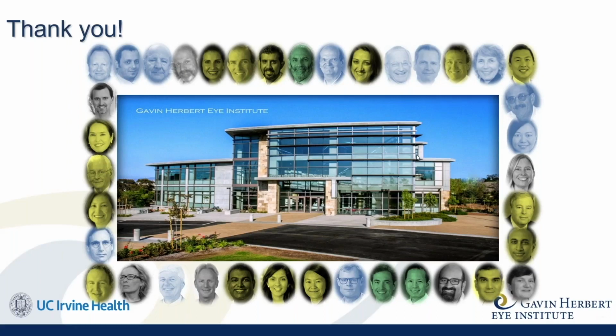We haven't studied people with color vision deficiencies using the FM100, and I won't do that because I can't have my patients spend 30 minutes arranging the colors in the FM100. The anomaloscope is not something that I'm going to focus on either because it neglects to address blue vision.